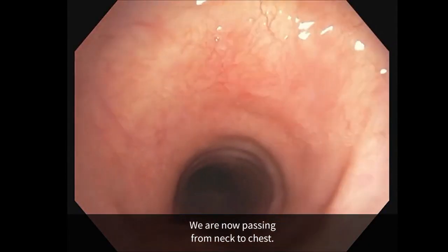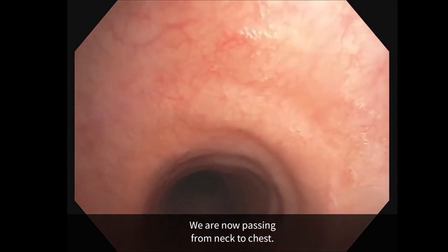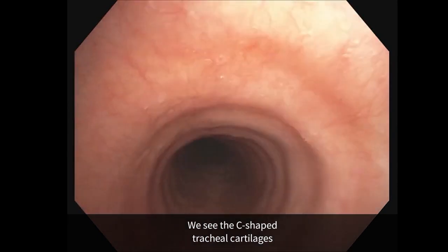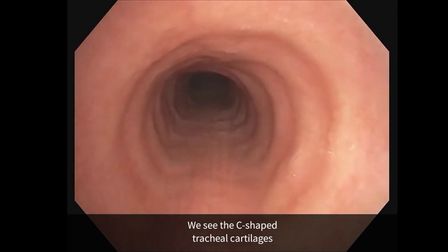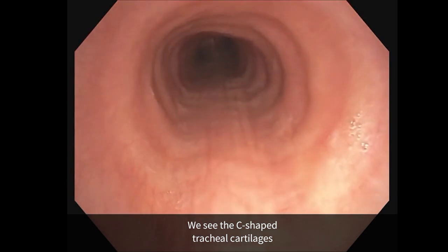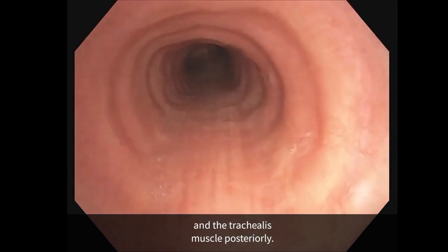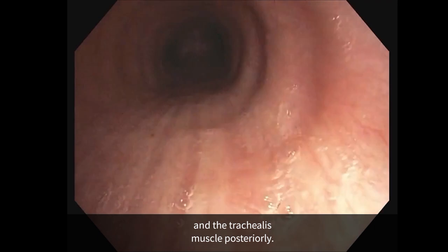We are now passing from neck to chest. We see the C-shaped tracheal cartilages and the trachealis muscle posteriorly.